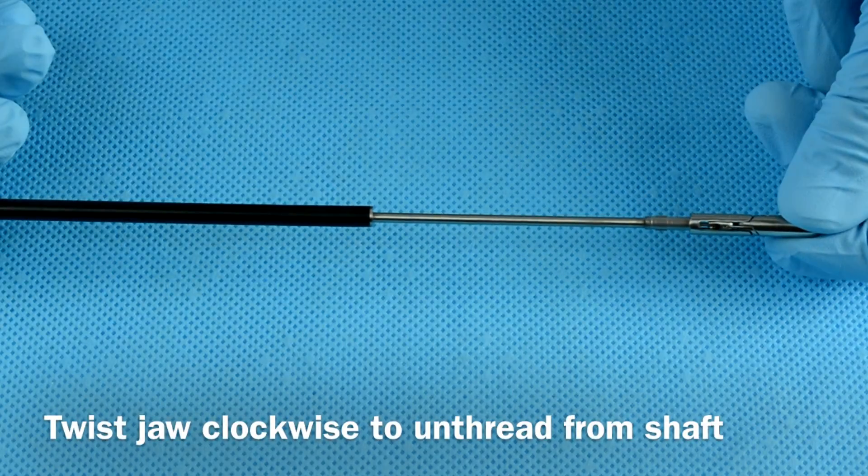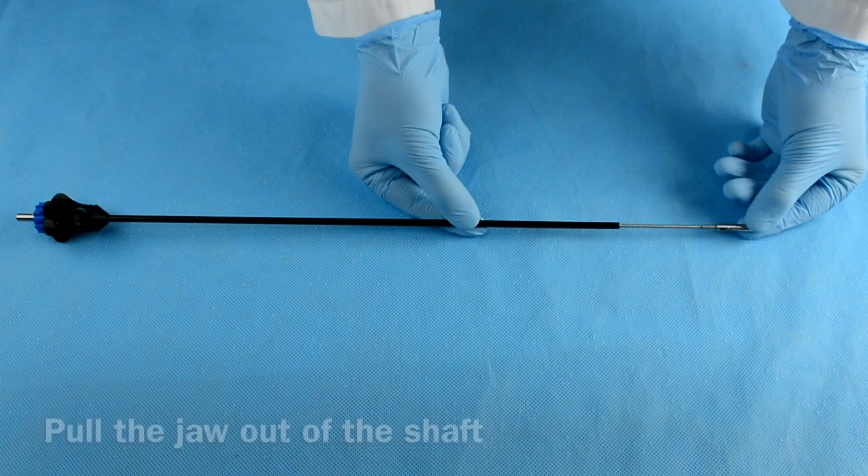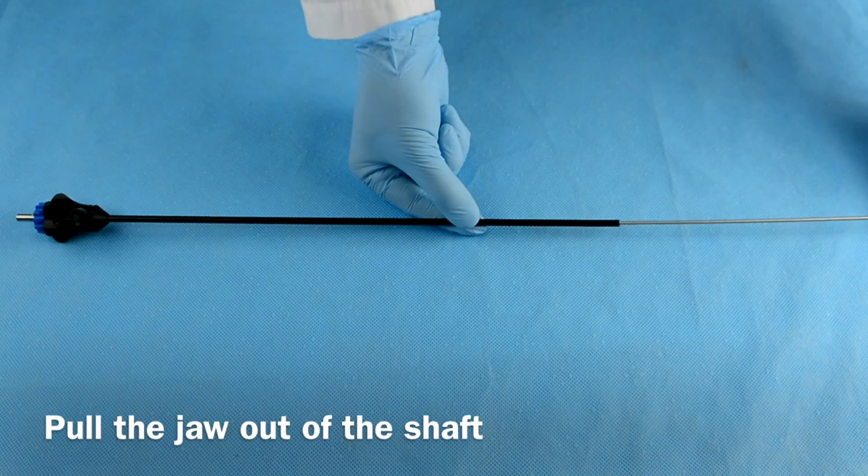Next, twist the jaw clockwise to unthread it. Lastly, pull the jaw out of the shaft.